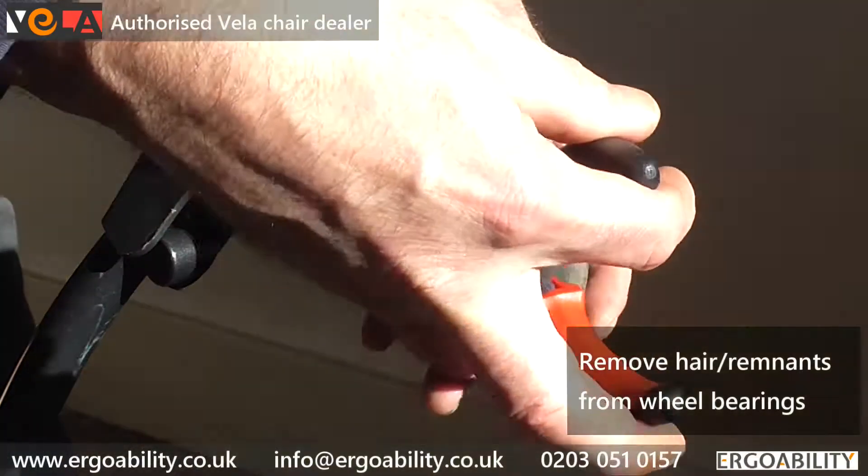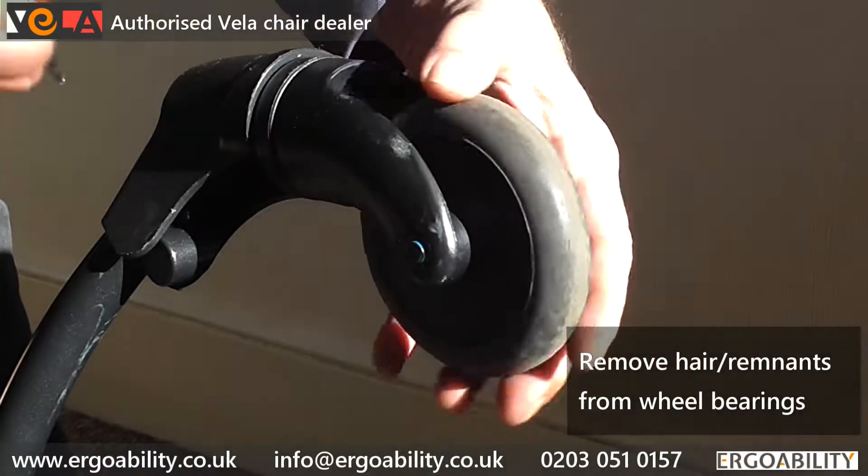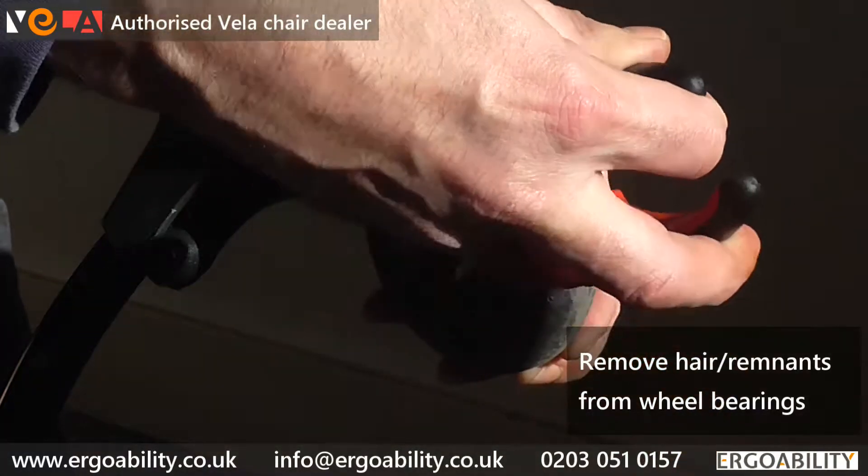We recommend that the wheels are checked regularly to remove any thread remnants or hairs that might obstruct free movement.